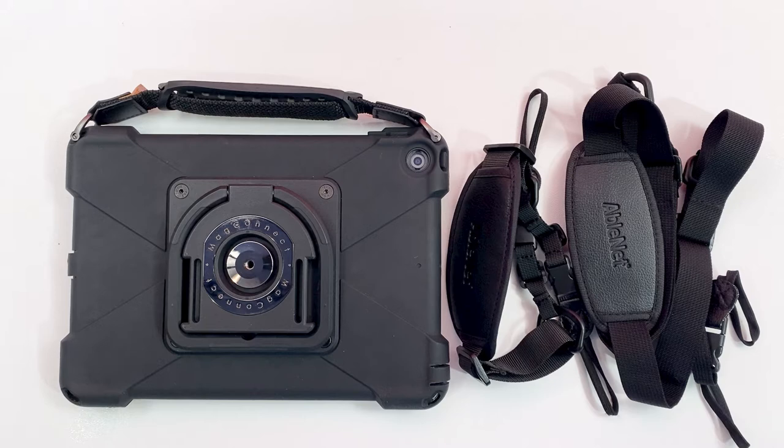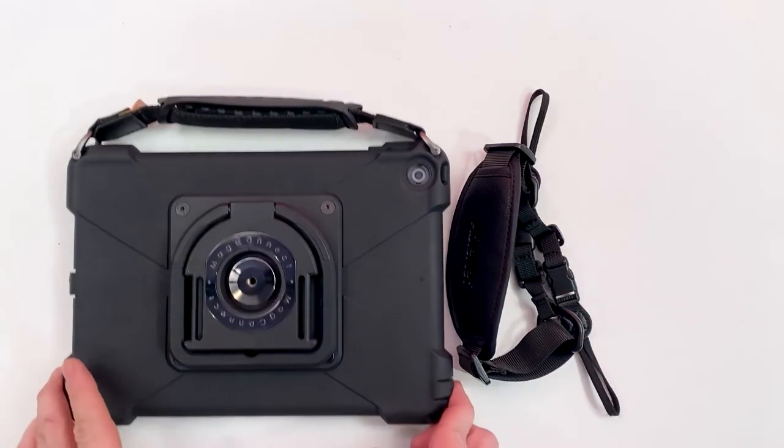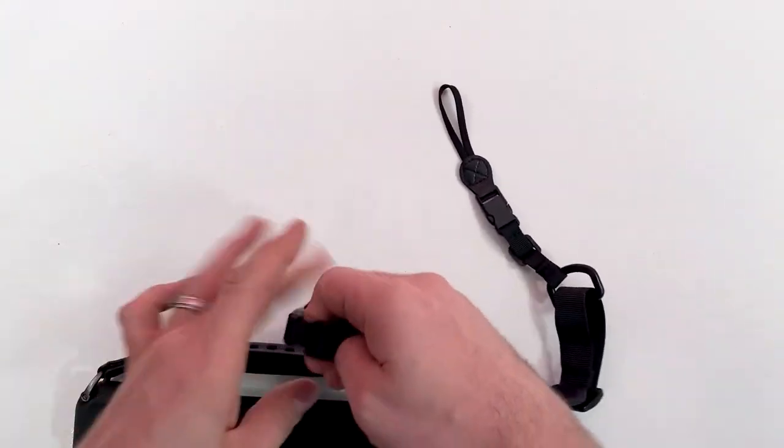To begin, determine which strap you want to attach to the Quick Talker Freestyle. Next, release the quick release clips on both of the loop ends of the strap.